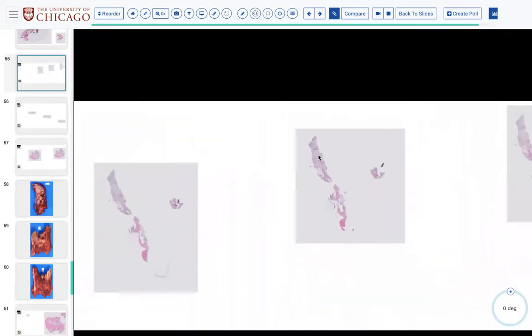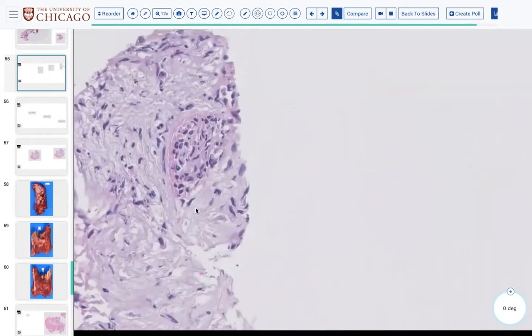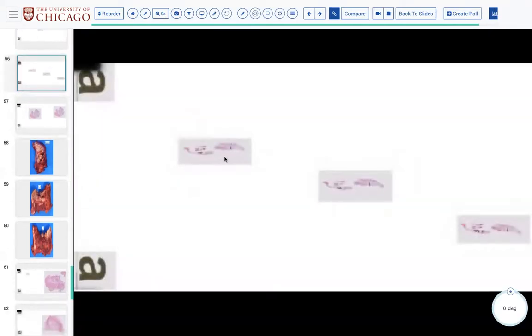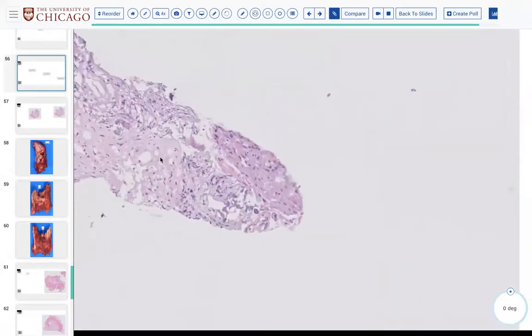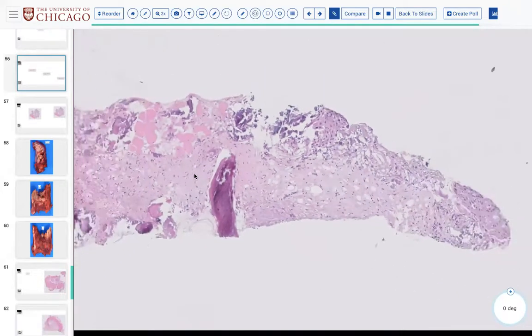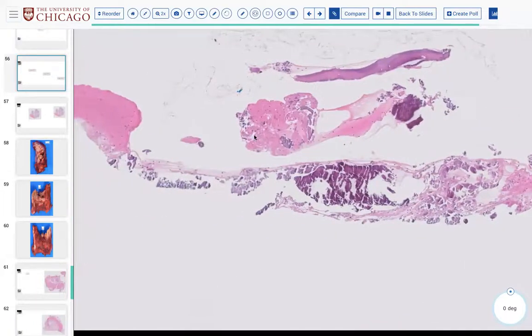Yep, let me see if it's clearer over here. So I did levels on this case because I was like, oh man, that looks like epithelium that's atypical, that's embedded in desmoplastic stroma. Exactly. So that I think is what was on the frozen. It's scary because this frozen was called, I think, rare atypical squamous epithelium, favor benign, no obvious cancer.